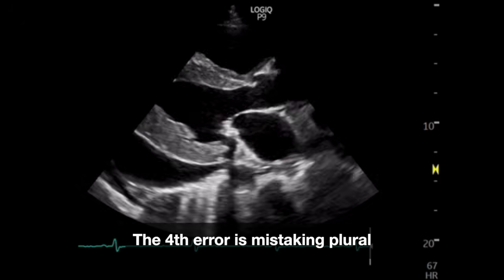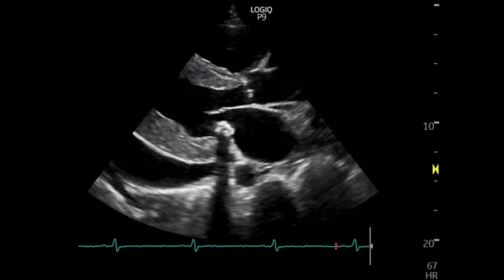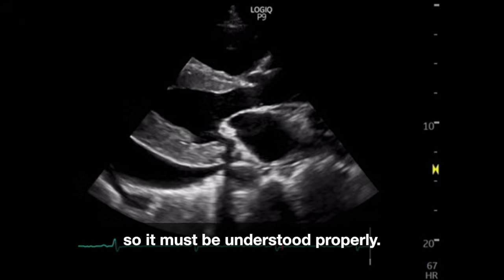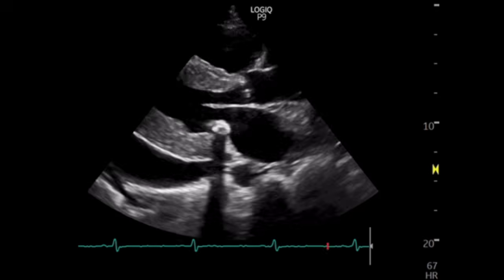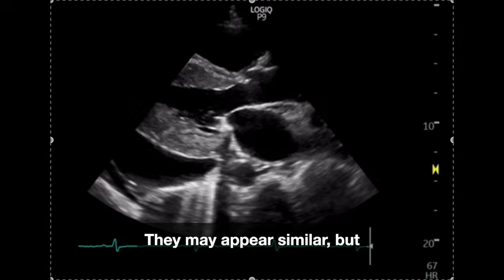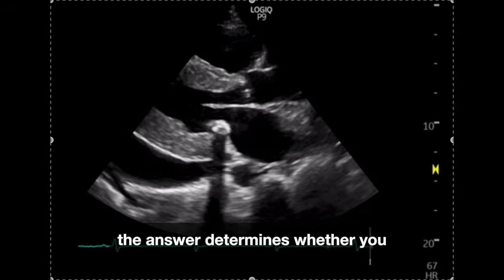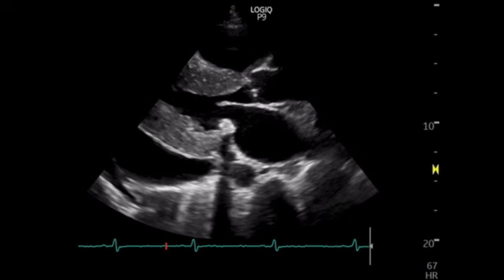The fourth error is mistaking pleural fluid for pericardial fluid. This distinction can change management, so it must be understood properly. There is fluid behind the heart. Is it pericardial fluid or pleural fluid? They may appear similar, but the answer determines whether you are considering cardiac tamponade or a chest drain.